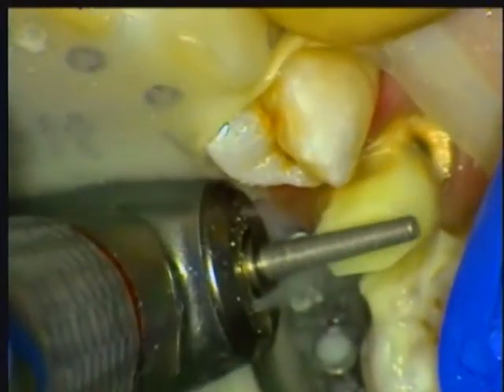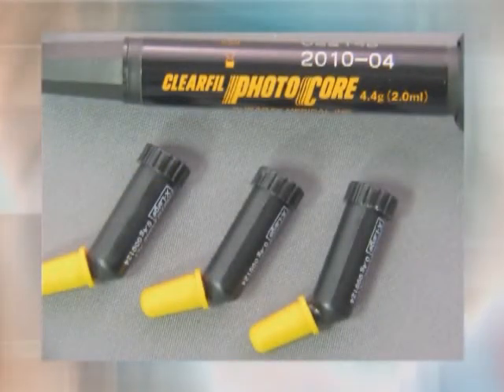I don't have many buildups that are deeper than 9mm, so I only have to cure one time. Once it's cured, it feels and cuts like dentin. It comes in a translucent shade for aesthetically pleasing final restorations and is easily seen on radiographs. When we take a badly broken down tooth and build it up to receive a crown or bridge abutment, it's good to know that the substructure will have the physical properties necessary for strength and longevity. You can rest assured with ClearFill PhotoCore. As clinical dentists, we may not always appreciate the numerical values of the tests for strength, hardness, and elasticity, but we are glad to have a product like ClearFill PhotoCore that excels in all these categories. Because confidence in the strength and durability of our buildup procedures is essential, I recommend that you reach for ClearFill PhotoCore.